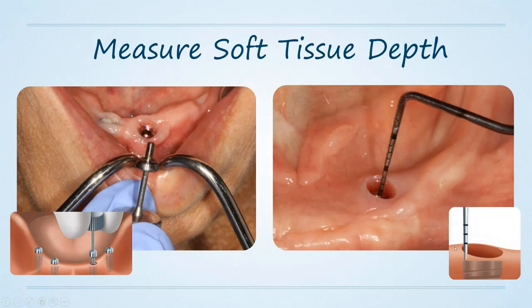And you can see here that not all ridges are made equal. Even though if the implant was right here, you'd see 1, 2, 3, maybe over in here, it might be 2 millimeters. How would we address that? Well, I'm going to show you that step right now. But this is just kind of a general protocol. I unscrew the healing abutment, take a measurement, and then the patient goes back home.